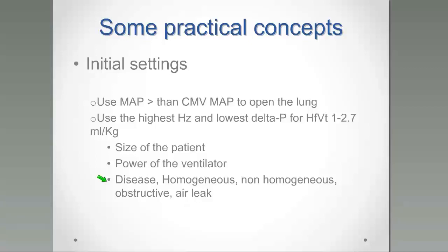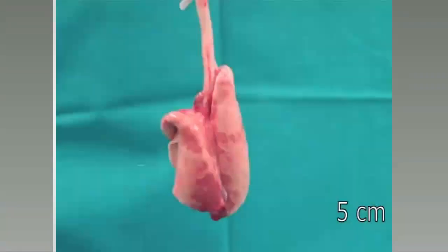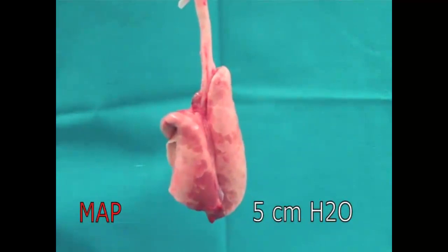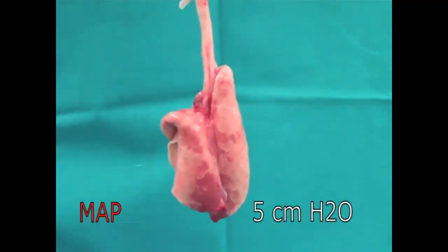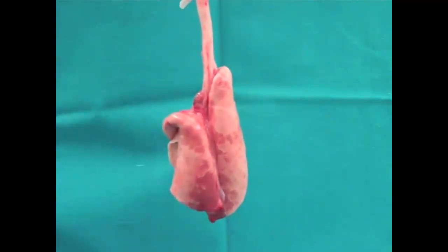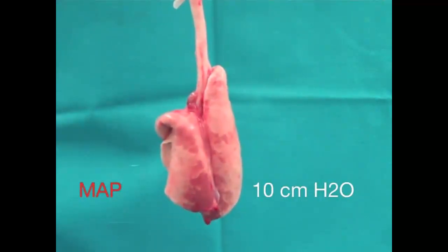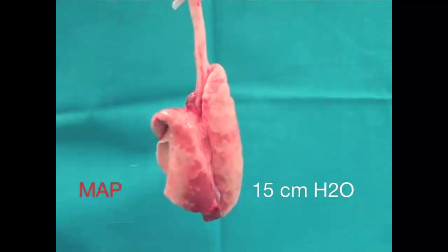So let us go again to the animal lab, and now let me show you in this new movie how we do these increments of the mean airway pressure. This is the video. And now we are using a very severely distressed lung from a piglet with a bronchoalveolar lavage, and you can see how we are ventilating these lungs, increasing the mean airway pressure.